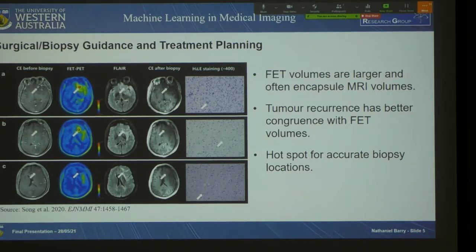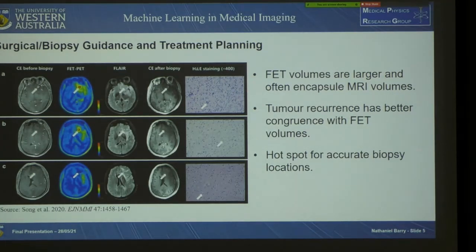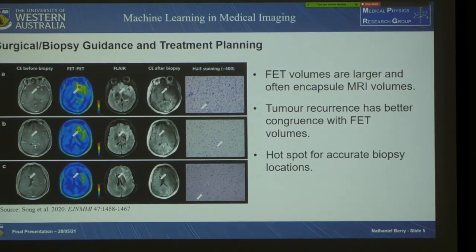An example of this is from a really recent biopsy study. On the top row we have a biopsy location that has contrast enhancement on MRI and is also positive for FET uptake, which showed glioma tissue upon analysis. On the middle row we no longer have that contrast enhancement on MRI but we have positive FET uptake still, and that still showed glioma tissue. Then there's a test where a biopsy location without contrast enhancement on MRI and without FET uptake but within abnormal signal on T2 FLAIR seemed to show mostly normal healthy brain tissue with minimal tumour cell infiltration.